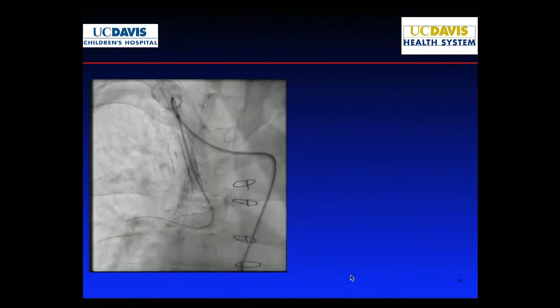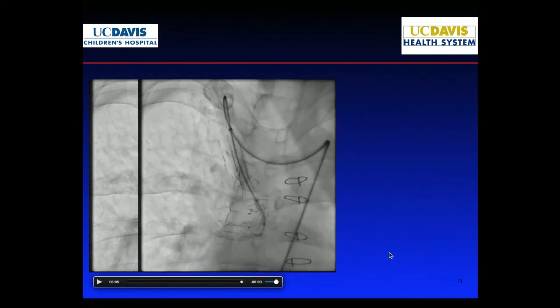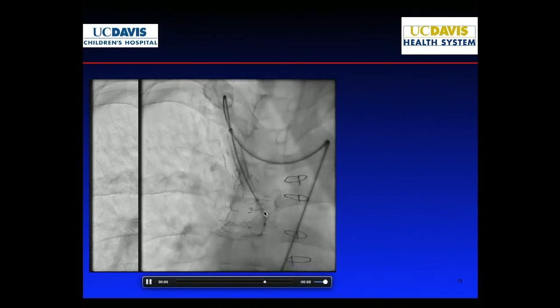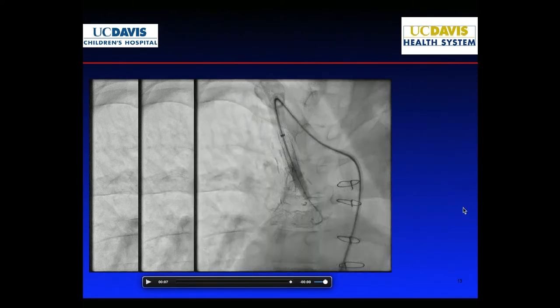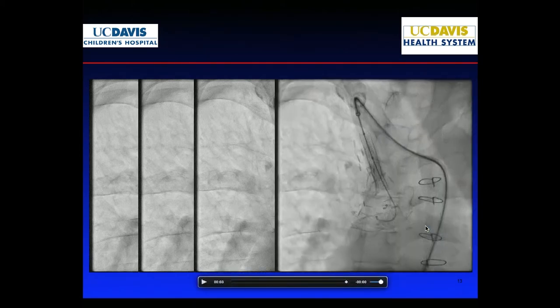So at this point, see how, just to show that when you have these coaxial systems with curves, every time you push something else backs up. And we were able to finally get a balloon in there, and I wanted to balloon the side of that stent as a way to just open something up there first. And in fact, with the balloon up, we're able to run with the balloon up to anchor it, giving some counter traction, you can actually now run the sheath in. So now we're at least into the stent inside the BT shunt first. But you see how we're losing wire position each time.